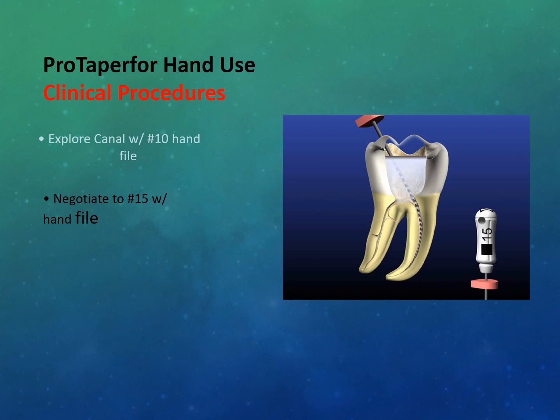A patient comes to you with severe pain on a lower first molar. So you have decided to start a root canal treatment. The first step is you have to give LA, and then rubber dam. Isolation is important. Rubber dam, and then you start your root canal treatment.